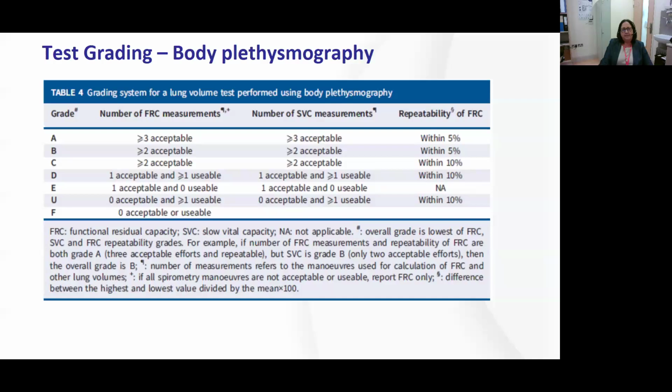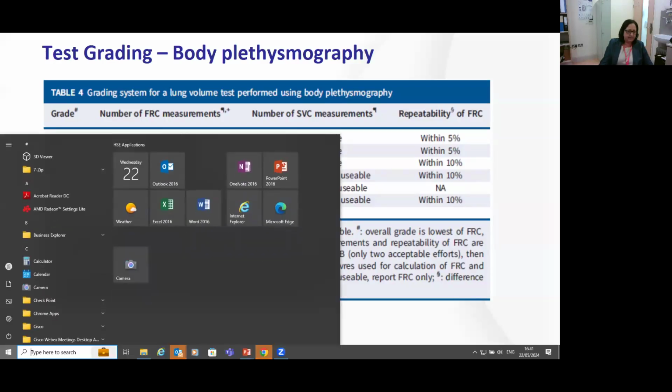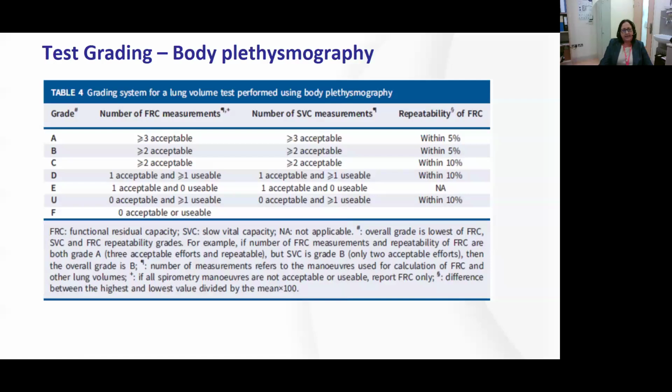So the advantage of grading the overall test is that it will really support people in their reporting capacity of the test and reviewing the quality of the measurement. What we've put in the standard is that we hope that the manufacturers will take this on board and that they will implement this in the future. But especially, we're interested in this validation work, if at all possible.